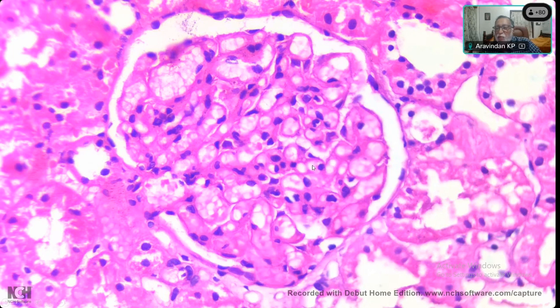In a 5 micron section, above what number of nuclei would you call it really increased? Let's say something like more than 75. Yes. This definitely seems to be below that. Even with smaller numbers, sometimes in the mesangial area, the nuclei can be bunched together just in the mesangium. So even the total may not exceed 75, but you will find bunching of cells, and that is called minimal mesangial proliferation. Here, even that is not present.